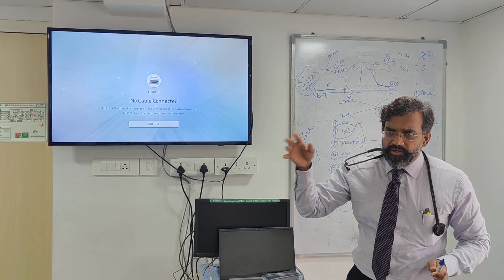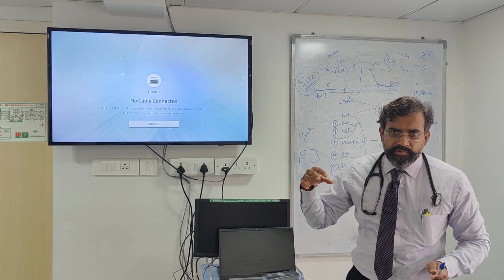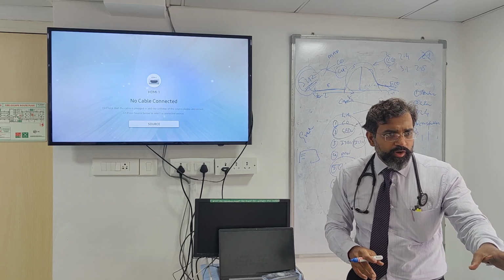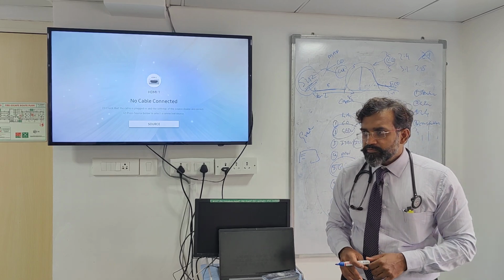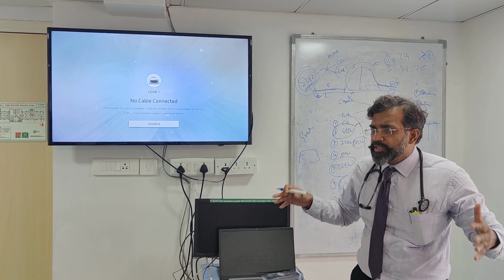From your normal monitor, put PPV, and it will come. Your PPV will start coming. But the PiCCO per se will not give you PPV. For example, if you take a FloTrac monitor, you will not get PPV, you get SVV. You will not get PPV, only stroke volume variation.